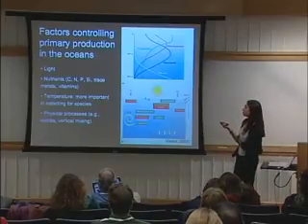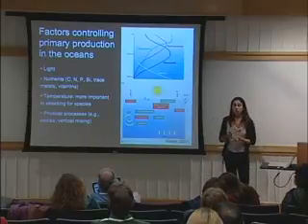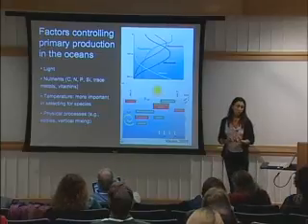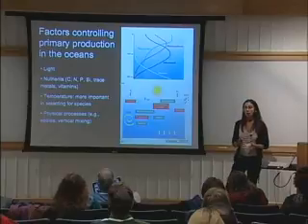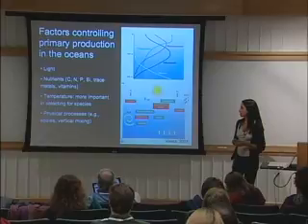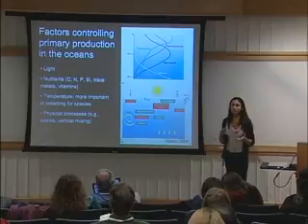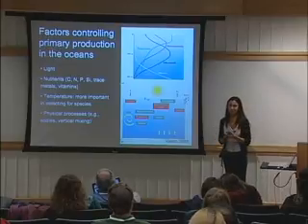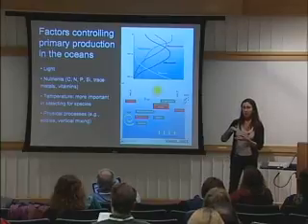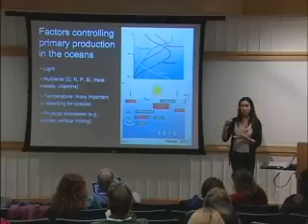Well, they need light to grow, so these are the main factors controlling primary production. They need nutrients, and in terms of nutrients, what we do in the cultures is we supplement seawater, or we make artificial seawater from scratch, and we add a source of nitrogen, a source of phosphorus, trace metals, and some vitamins. You may have axenic and non-axenic cultures. I do not believe in axenic cultures in my condition, so I just don't grow axenic cultures, but I keep bacterial levels as low as I can by subculturing them very often and by maintaining very diluted cultures.